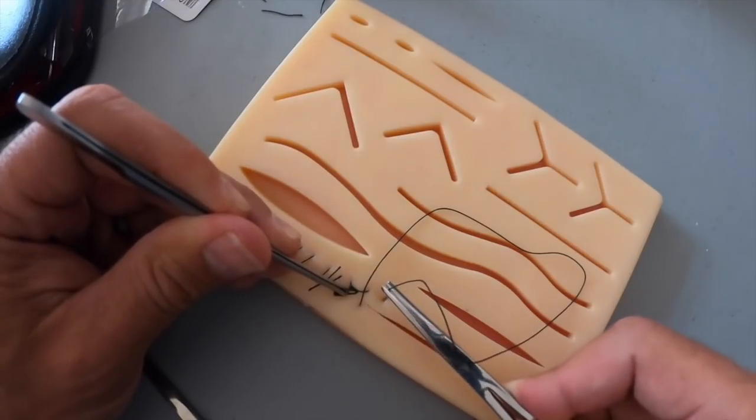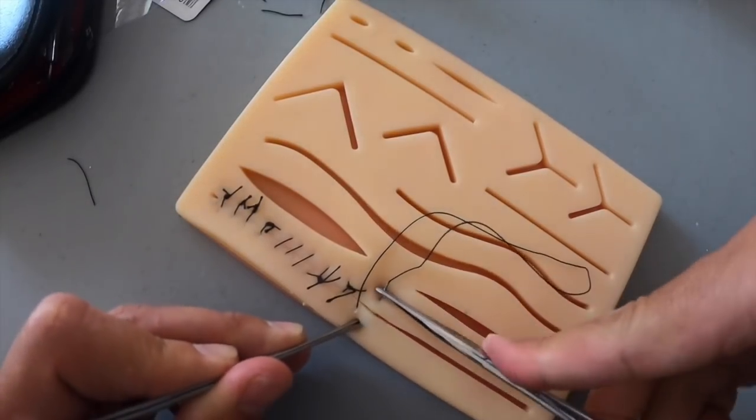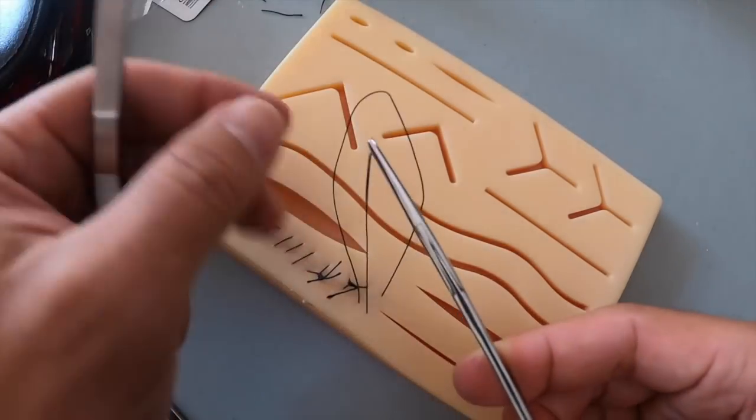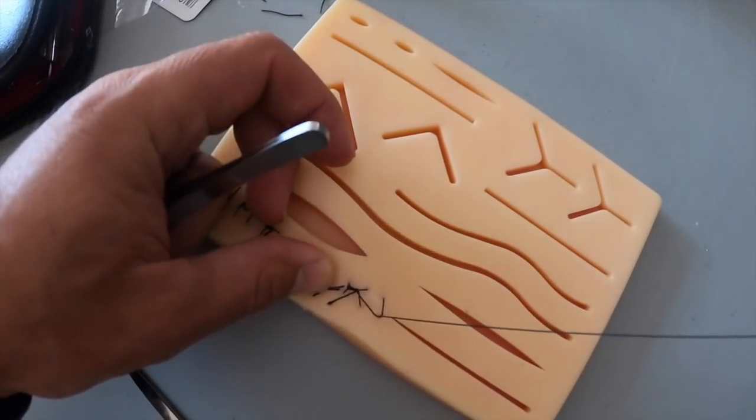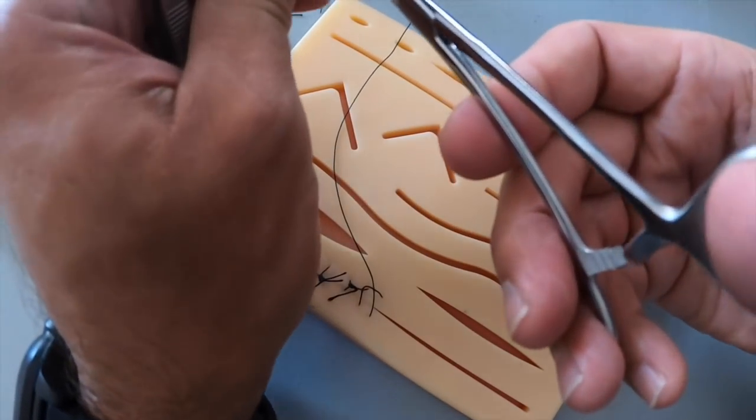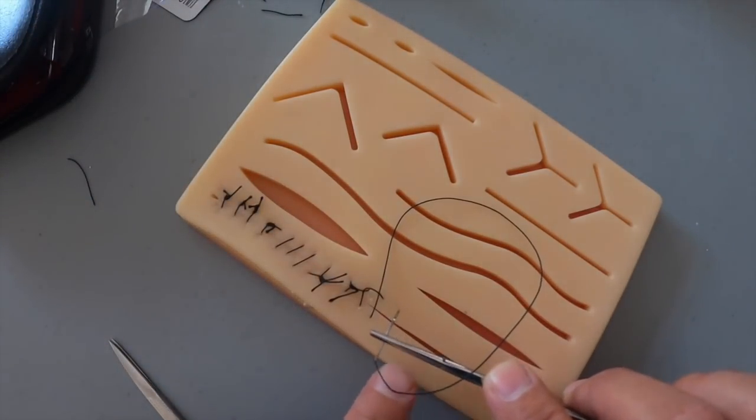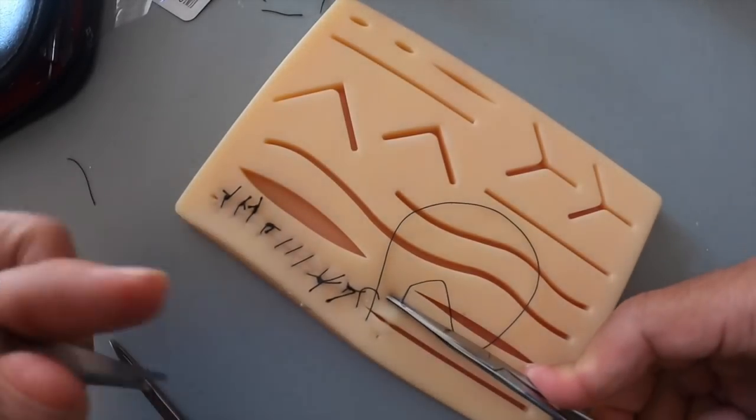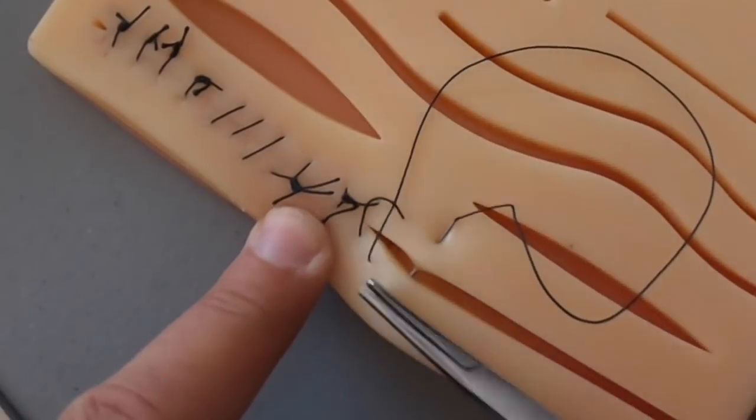So perpendicular to the wound, I'm just going to go a little bit quicker here. And out, but this time there's my loop, go through and pull. And again and again.